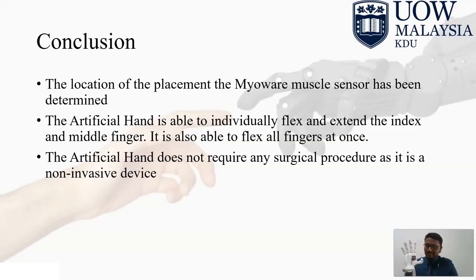At the end of this, I'm going to be showing a short demonstration video of how the full functionality of the artificial hand will be used.